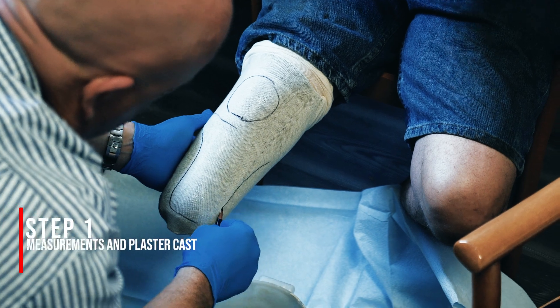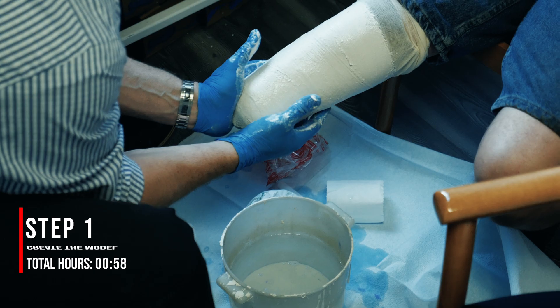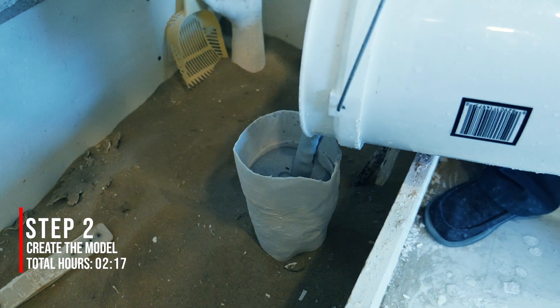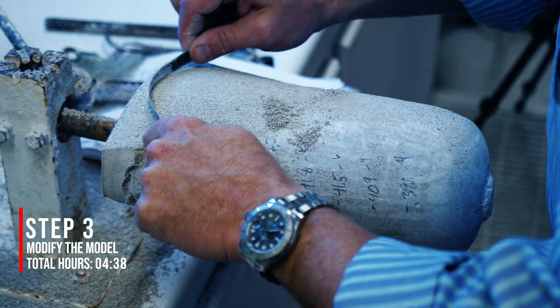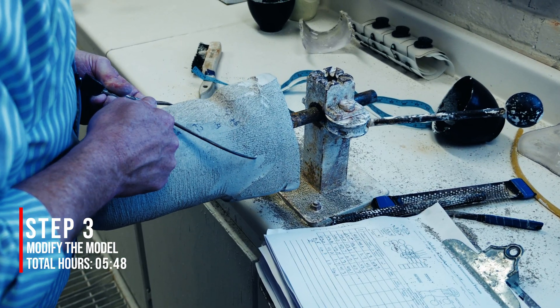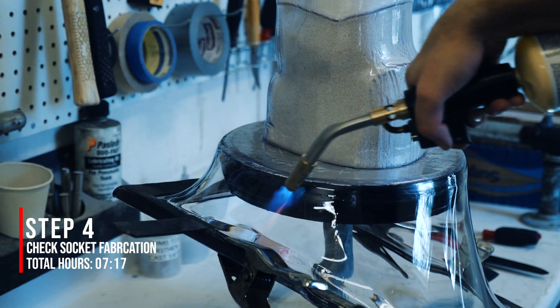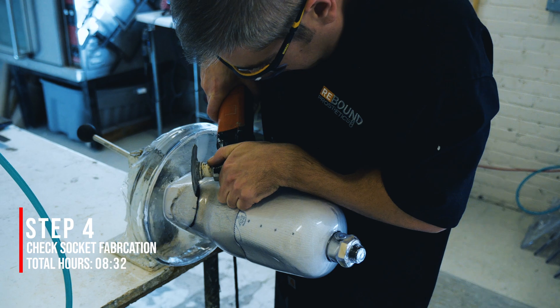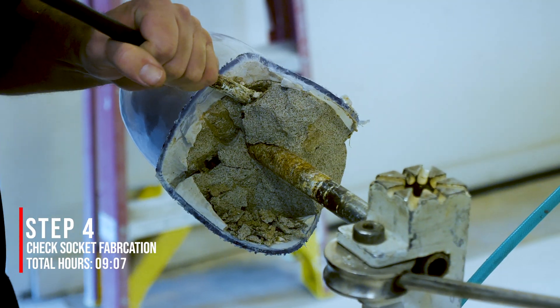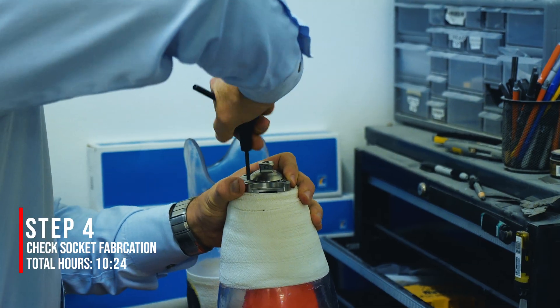The steps involved in creating a socket include taking measurements and a plaster cast of the residual limb. From that, a positive model is created and the practitioner carves out and sculpts the model to the desired tension values. Next, a check socket is created by vacuforming molten plastic over the model. These steps include trimming excess material, breaking the plaster, grinding and smoothing the socket, and finally assembly.